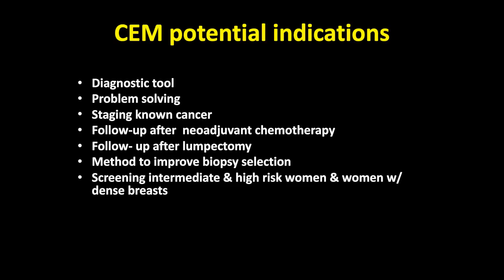So what are the potential indications? Well, certainly most of the early studies have been to use it as a diagnostic tool, and I think it is superb as such. Problem solving, staging known cancers, follow-up after neoadjuvant chemotherapy, follow-up after lumpectomy, a method to improve biopsy selection, and I truly believe screening for intermediate and some high-risk women and women with dense breast tissue.